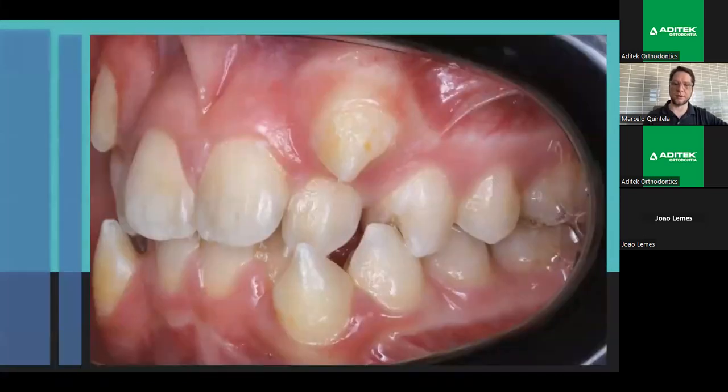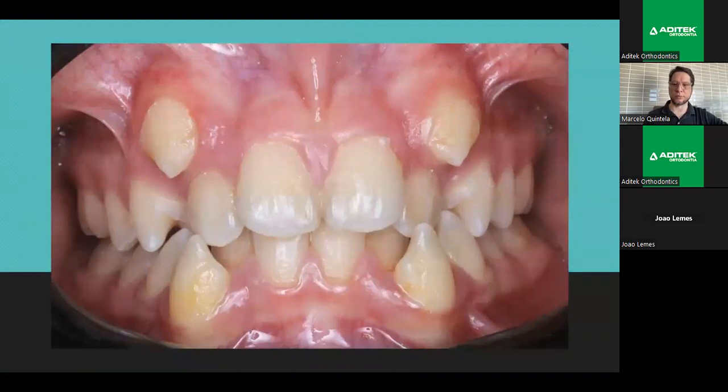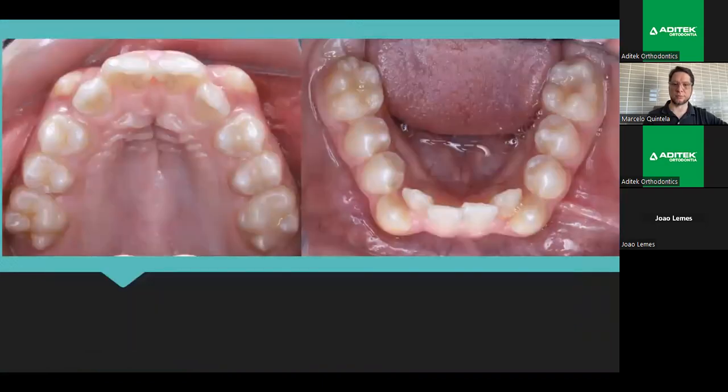Another side, frontal, and look for occlusion. It's impossible to put this canine here. But you can do that with distalization and some pro-inclination without loss of control.